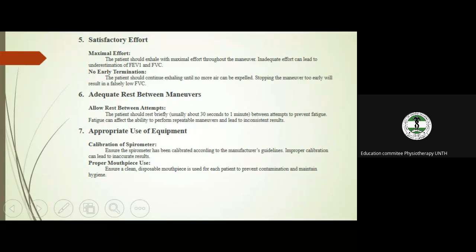Even our weighing scale, we calibrate in this spirometry unit. We are all separate. It's not like every other equipment that every other person is using. We have our own because we maintain them. We calibrate the machine, weighing scale, everything. Sometimes you measure the height, you check them often to see if there's an alteration, because all these things affect the spirometry result.